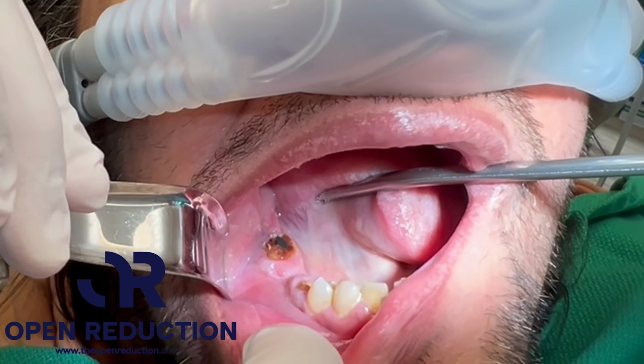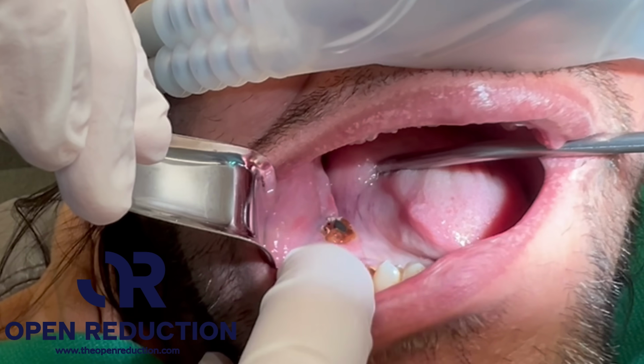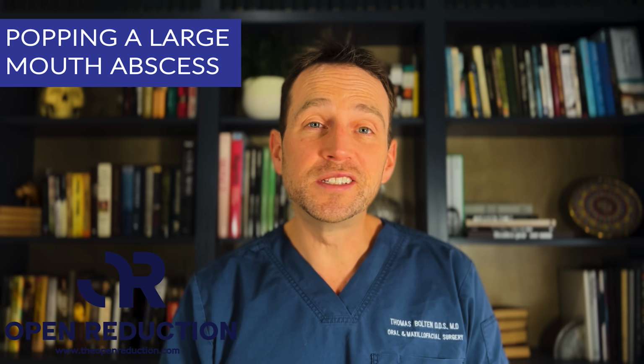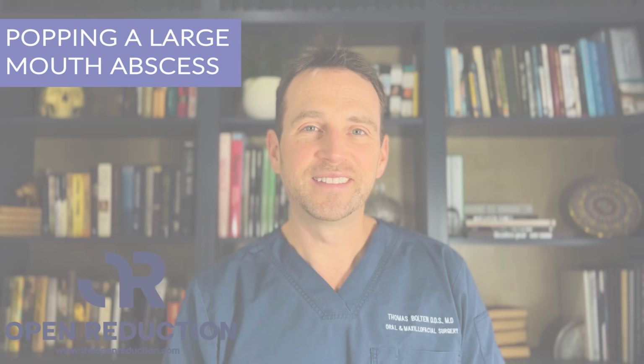A 49-year-old male recently fractured a dental bridge, and now his entire right lower face is swollen. Check out the surgical treatment today on the Open Reduction.